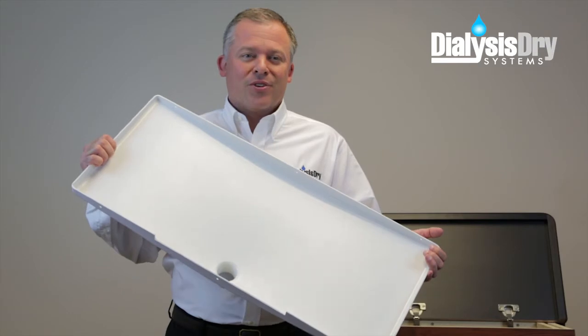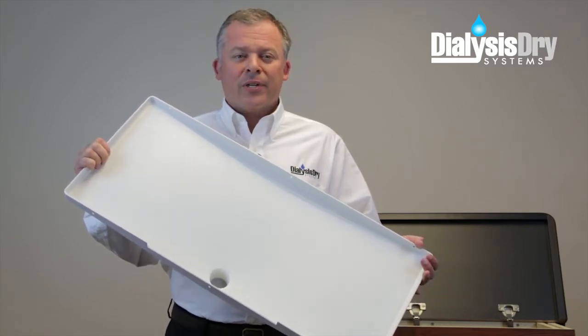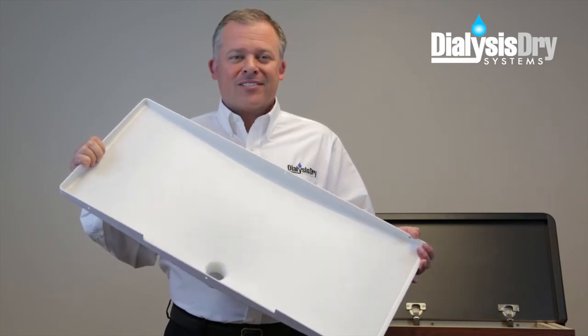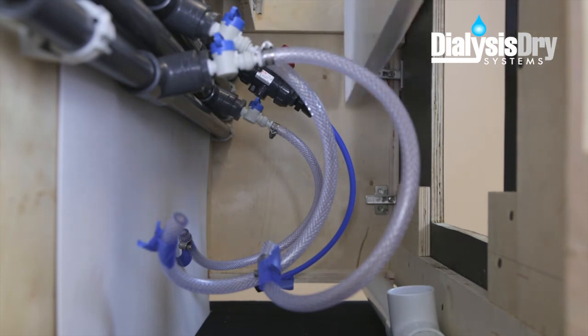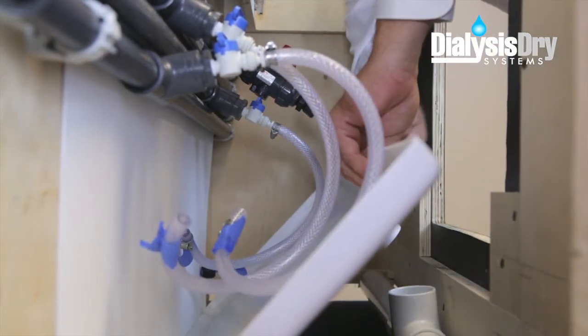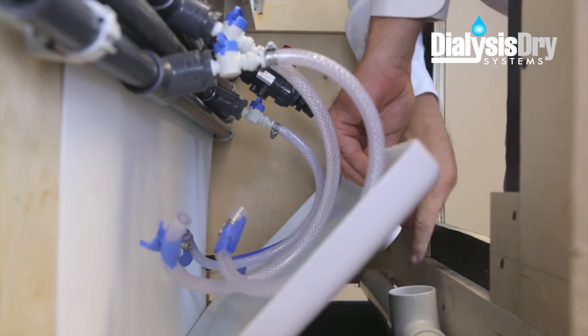Now, with the panel correctly positioned, it's time to install the DDS interceptor tray. Like the reinforced panel, insert the tray into the cabinet through the top opening, and be sure the tray drainage pipe is near the front of the cabinet. To move the tray into its proper position, place the tray drainage pipe into the existing drain pipe, located underneath the temporarily removed supply and waste box.